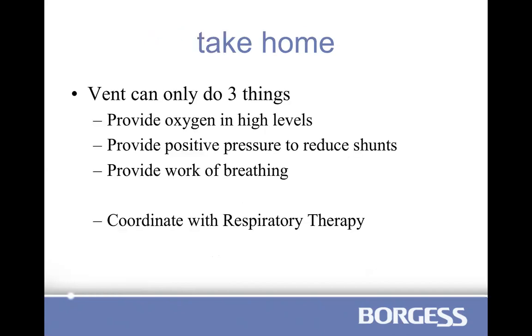Okay. So again, some quick take-home notes. The vent does three things. It provides your work of breathing, it provides pressure to reduce your shunts, and it provides oxygen in higher levels than you can provide via nasal cannula. Everything that you do with the vent, please coordinate it with your respiratory therapist. If you have a goal, if you know what you want to accomplish, but you just don't know how to accomplish that, talk to your respiratory therapist. They will help you, okay?